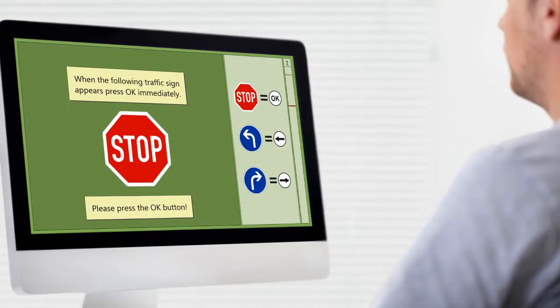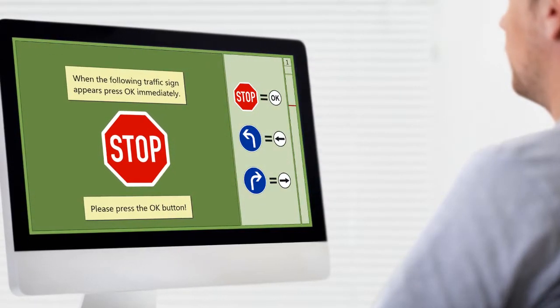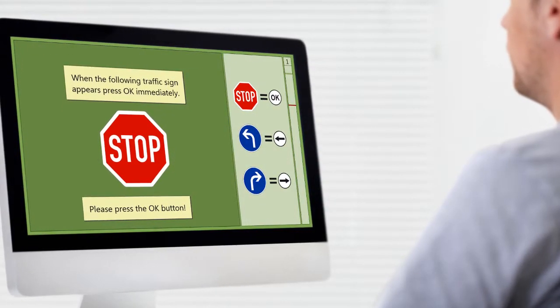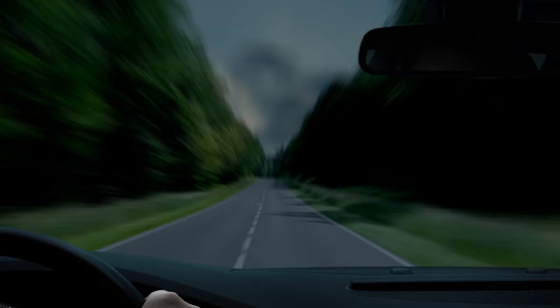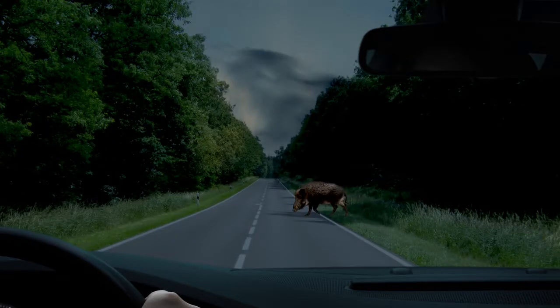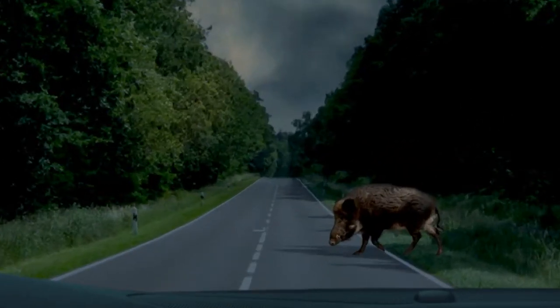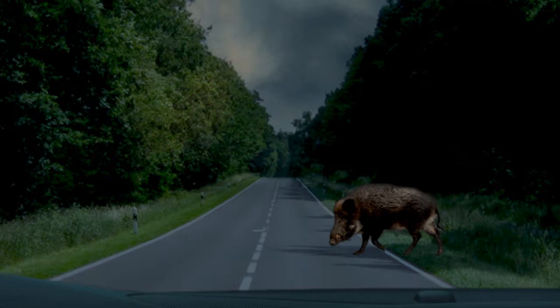The RehaCom module Reaction Behaviour trains alertness. It addresses the general readiness to react as well as the ability to raise and hold the attention intensity for a short time.